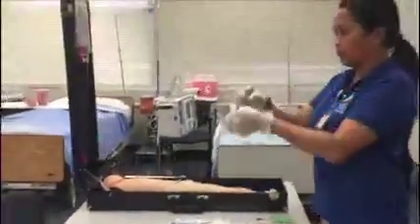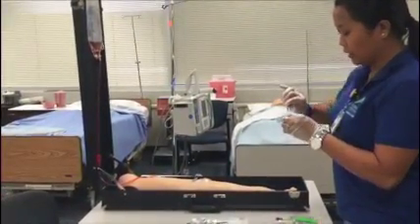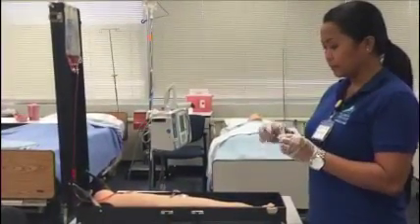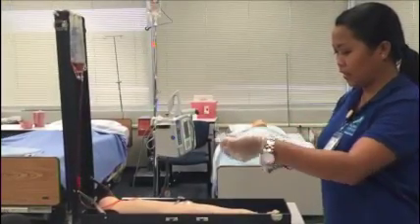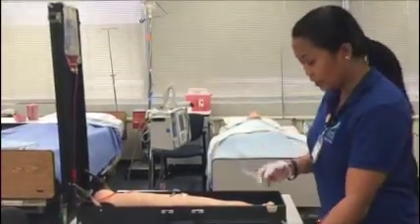All right, taking it out, and putting the blunt needle back in, and I'm going to change it to the regular needle. Putting it in, and this is ready to go. The blunt needle will go to the sharp container.